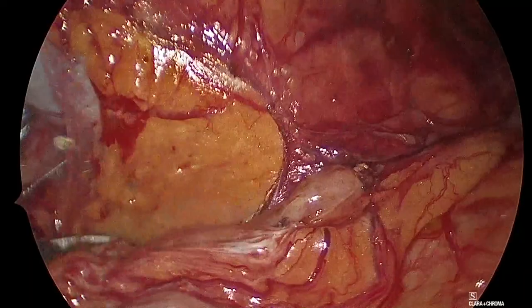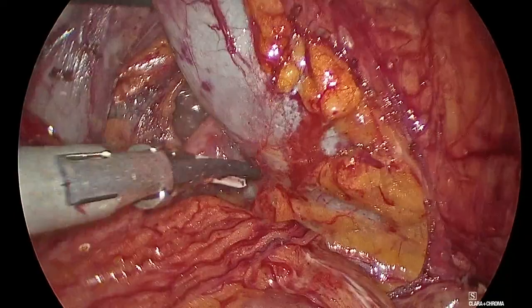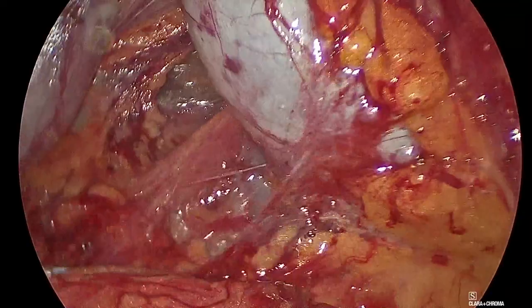Enséñame al central. Vamos aquí. Okay. Move here. Okay, so now we know that there is an artery here. We don't know yet where the vein is, but we need to be careful because where there's an artery, there's always a vein. So there might be the vein right there. In fact, I think that this is one vein, not the main vein, I would say, but one vein.